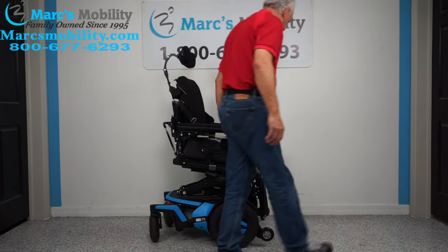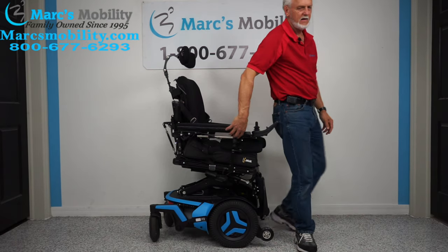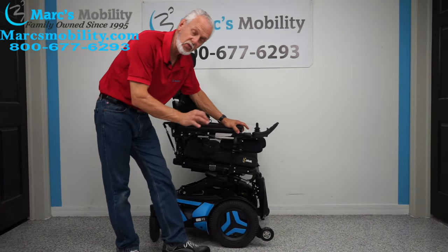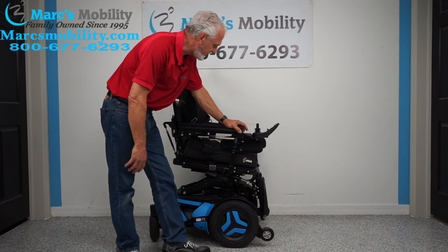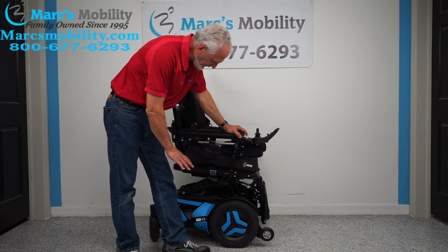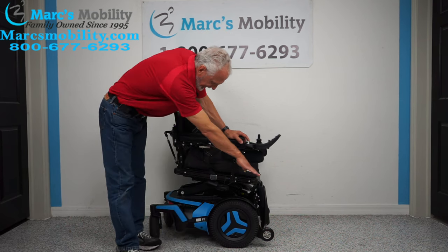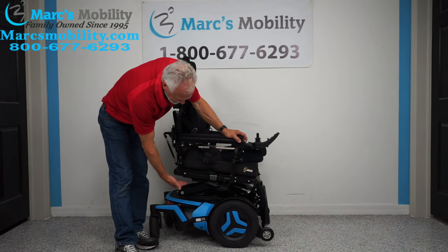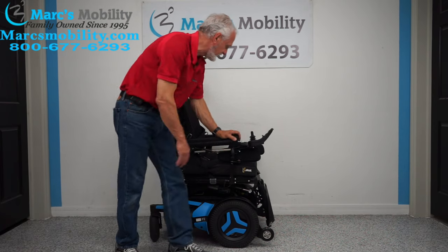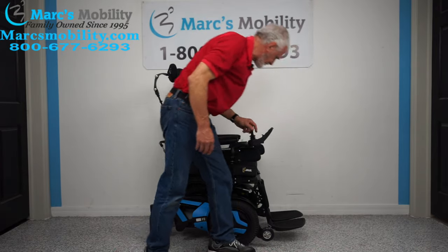If you were here — I'm six foot tall — by the time you put your feet down you're standing. So that's a good example of what those two things will do for a person who cannot get out of their chair. I'm going to bring the seat lift back down and bring the anterior tilt back down. Folks, this is just an incredible, incredible chair.